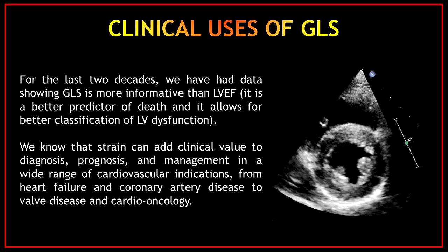We know that strain can add clinical value to diagnosis, prognosis, and management in a wide range of cardiovascular indications, from heart failure and coronary artery disease to valve disease and cardio-oncology.